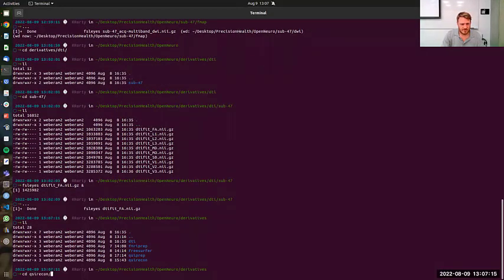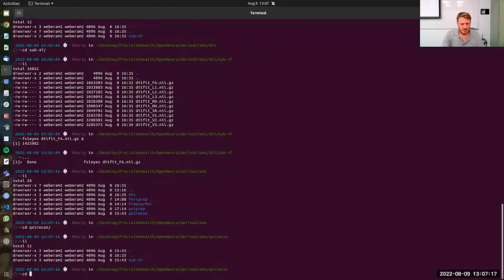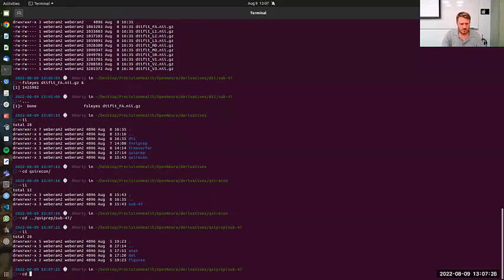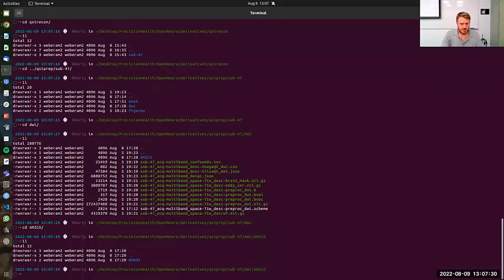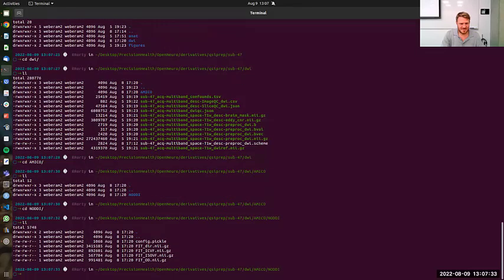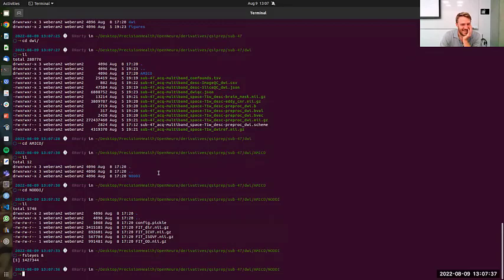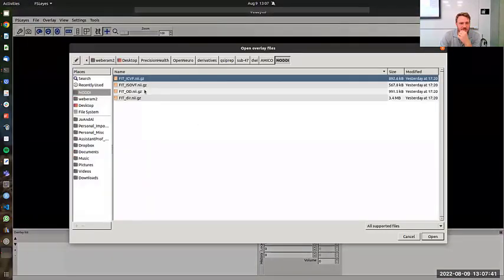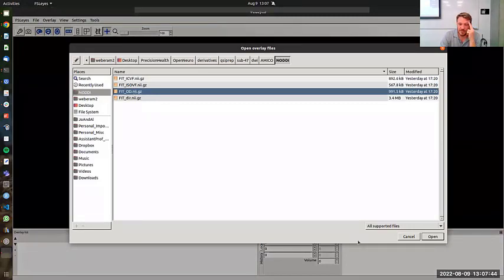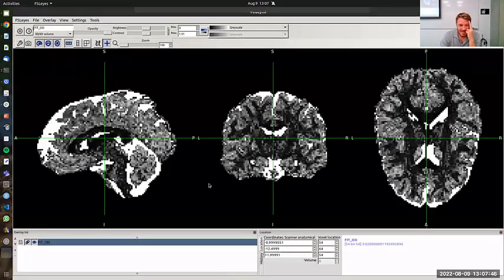I think I put it here. Yes, there is. I'm not an expert on NODDI, so this one is orientation dispersion.